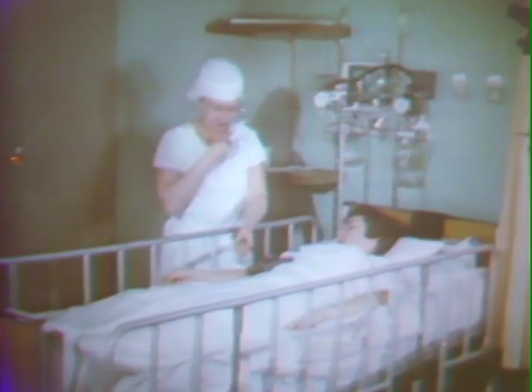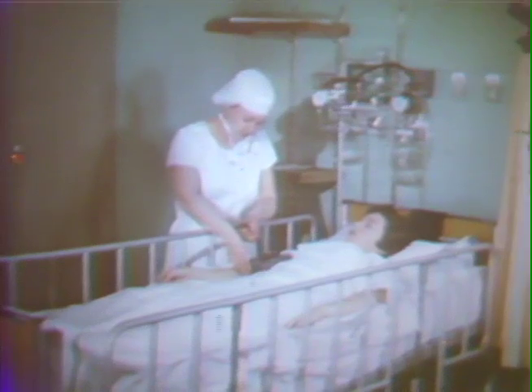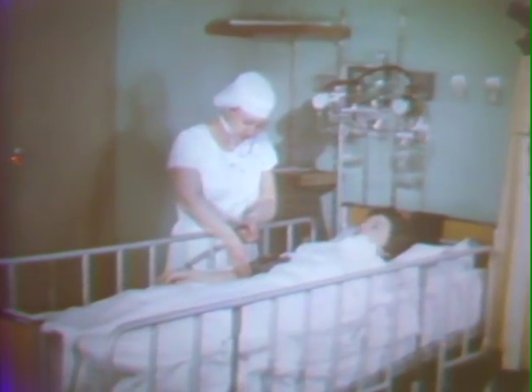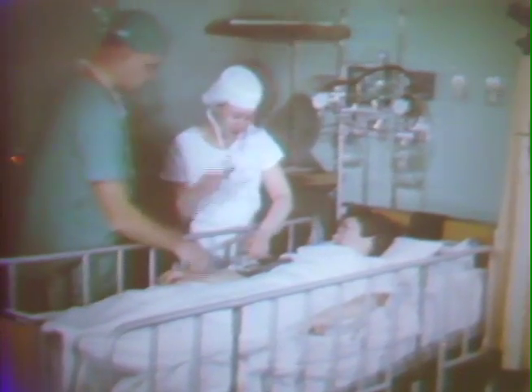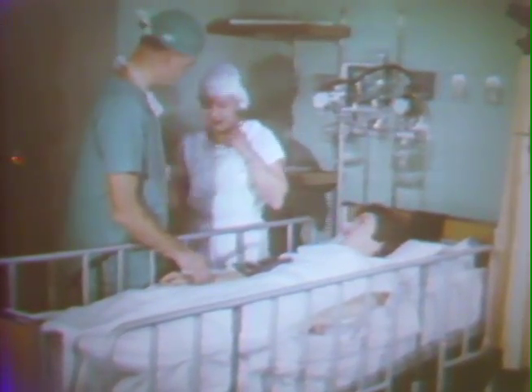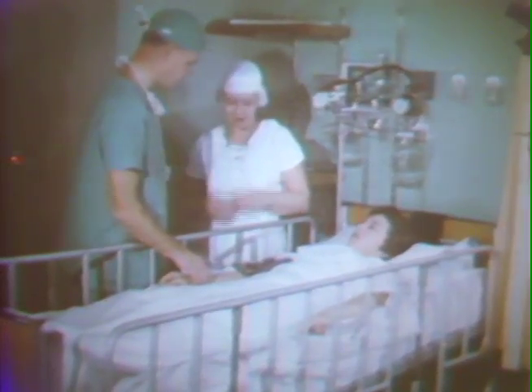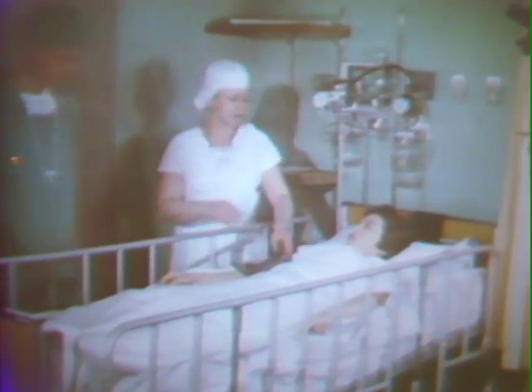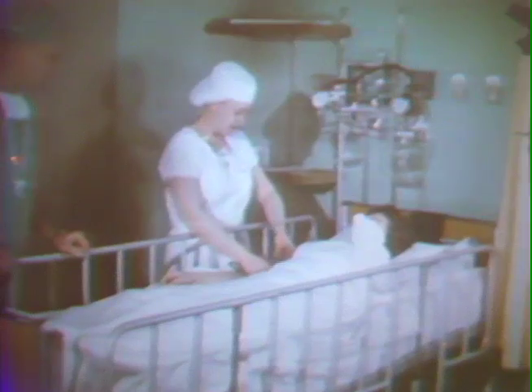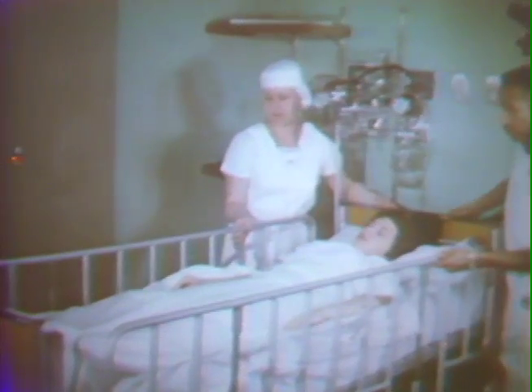Here, recovery from halothane anesthesia is usually rapid, with little tendency to nausea and vomiting. These factors make the care of the patient in the recovery room much more simple. Complications arising from the actions of a disoriented, retching patient are avoided. With careful administration of halothane, proper supervision of anesthesia during surgery, and good recovery room care, the patient returns to his room in the best possible condition.